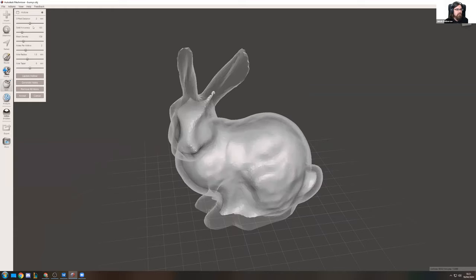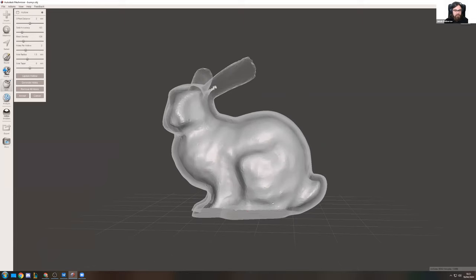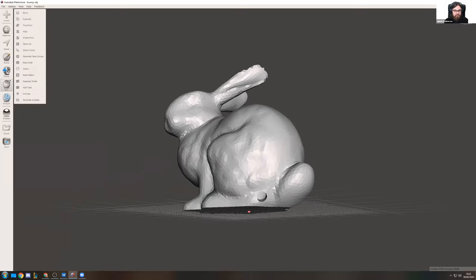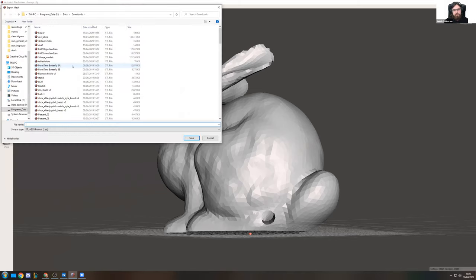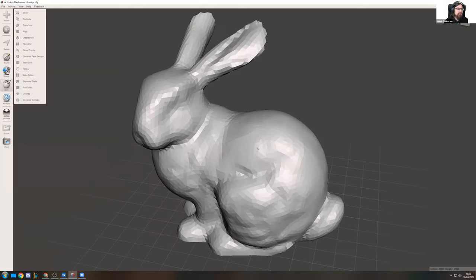Basically the main thing that you would set is the offset distance, which is the wall thickness of your model. I will just leave this at 2 millimeters. Then you can just double click on your model anywhere to set one of these suction holes. If you click on this red button, you can drag and drop it around to hide the suction hole. If you click accept, the whole model will be hollowed out, and you will have your suction hole in there. As you might have seen on the side, you have a lot more options to set, like the dimensions of this hole. But other than that, you would just click File, Export, and export it as a hollowed out model. And this is how quickly you can get to a hollowed out part.